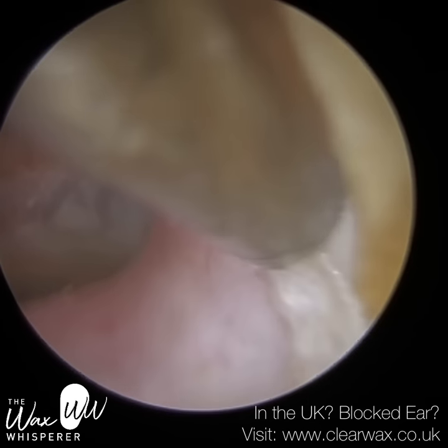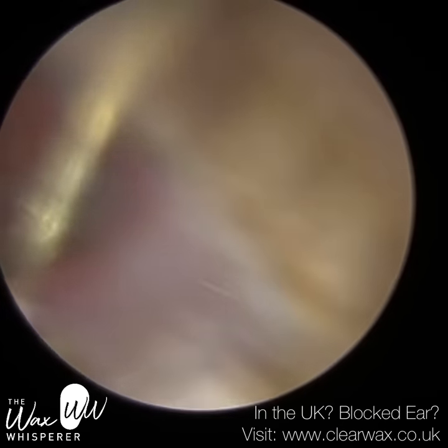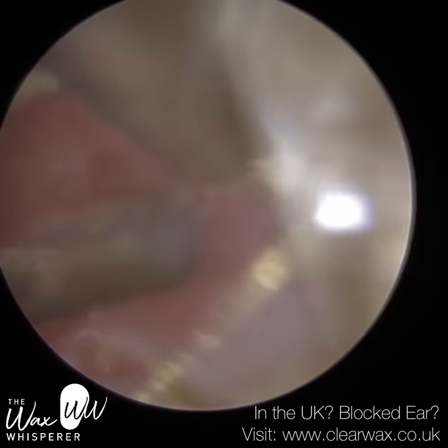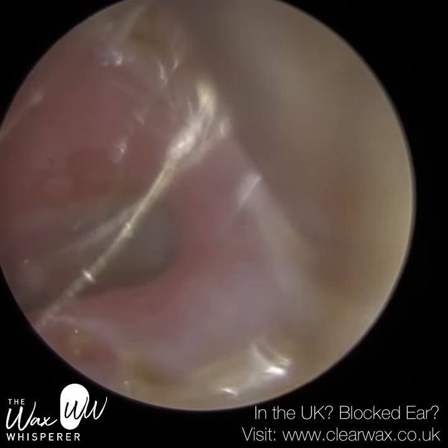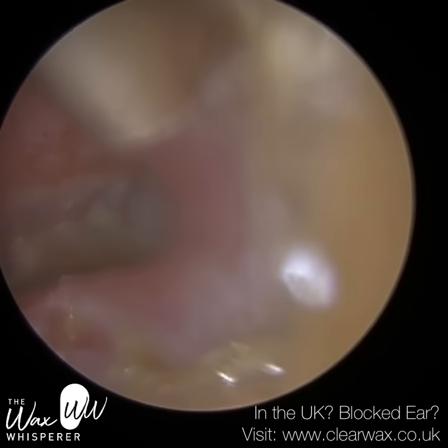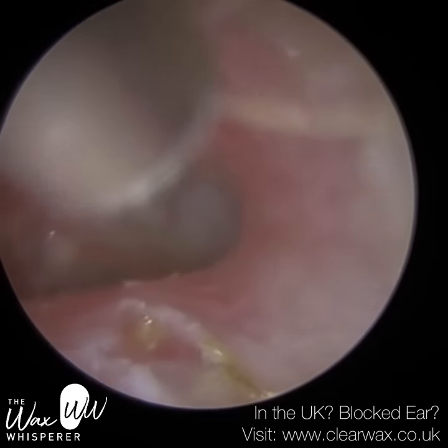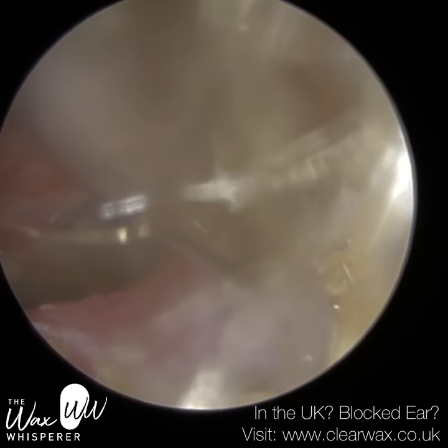I've just put some olive oil into the ear because there was a bit of dead skin that was more adhered — both laterally near the entrance and also near the eardrum. And once more I'm just using the fine end to peel this away. The patient emailed us back the following day to say how amazing they found the treatment, and they're very pleased indeed.